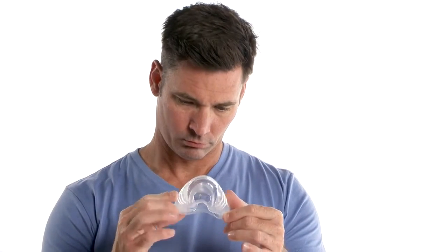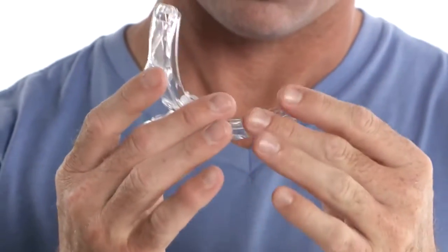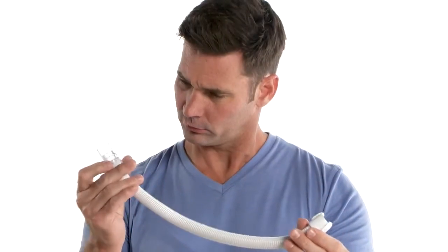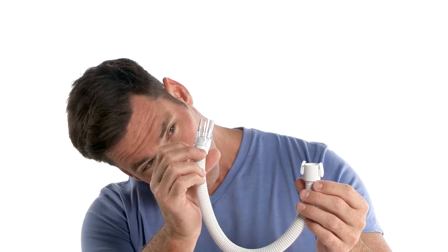Be sure to inspect your mask and tubing for damage or wear, such as cracking or tears. Discard and replace parts as necessary. It is important to follow these cleaning instructions for the proper function of your mask.